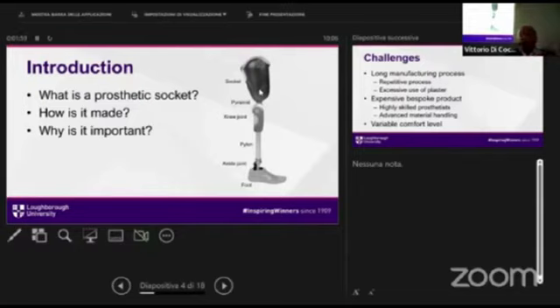So this clearly raises very interesting problems on the modeling part, but today I'm focusing on the structural integrity, and I would like to demonstrate the behavior of this type of materials. And for you to understand generally, even up to now, with all our technology, the production of the sockets is more of an art than a science.